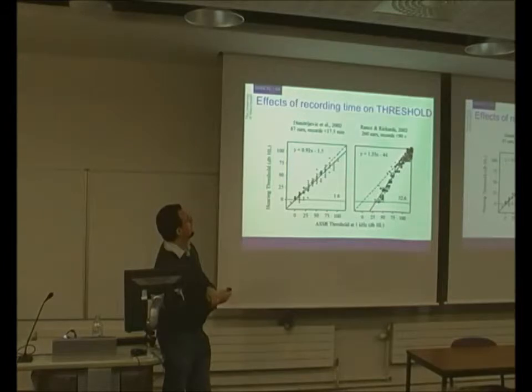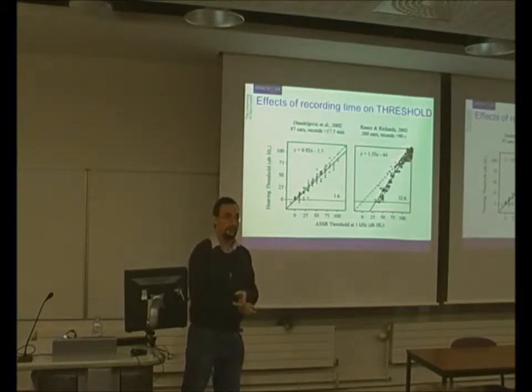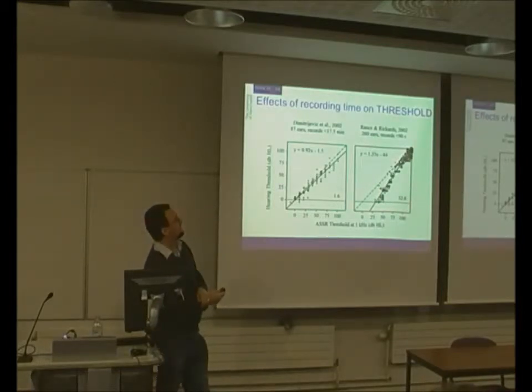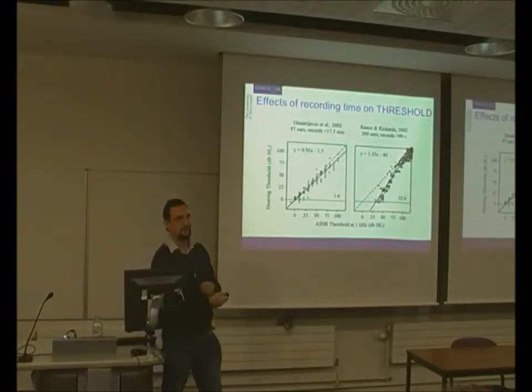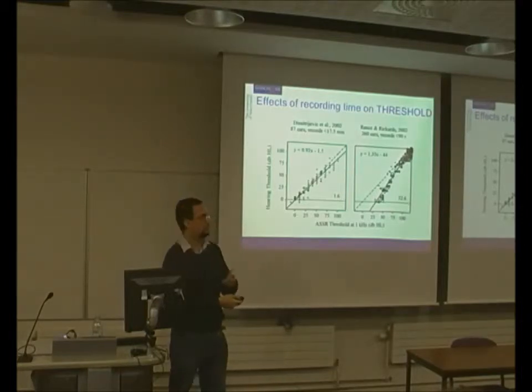Okay. So there are some mentions in the literature of other studies that have looked at the effect of recording time, which is what I'm going to focus on now. And so this study here, which is Rance and Rickards, they had very short recording times of only up to 90 seconds. So if it was significant, they stopped. If it wasn't significant, they carried on another 90 seconds to see if it arrived at significance or not.